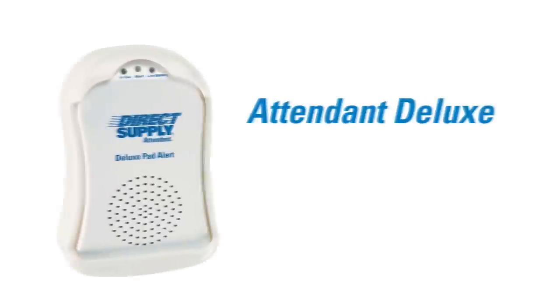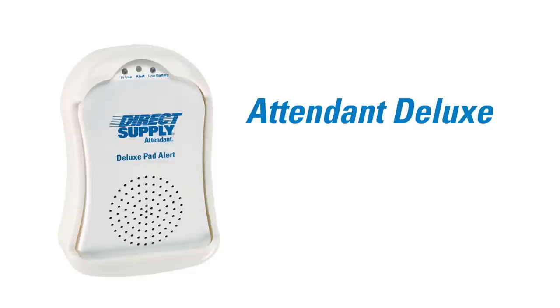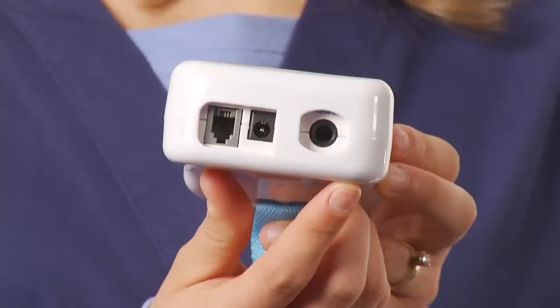The Direct Supply Attendant Deluxe Alarm provides additional options for noise control over the Direct Supply Economy Alarm. Unlike the Economy Alarm, this unit has no on-off switch and is therefore always active so long as there is a live battery inside.